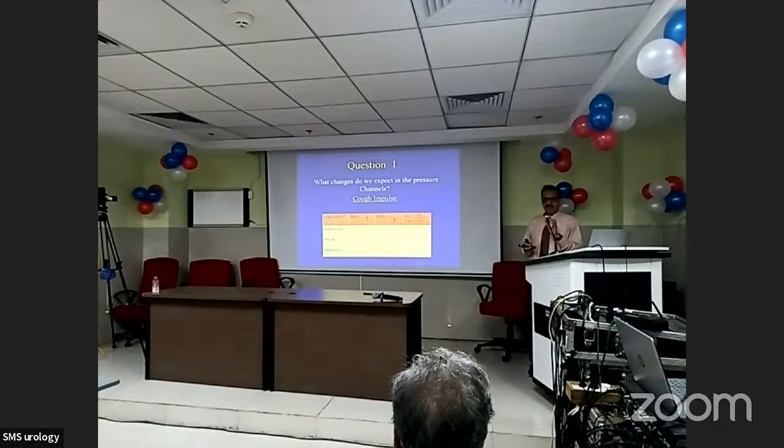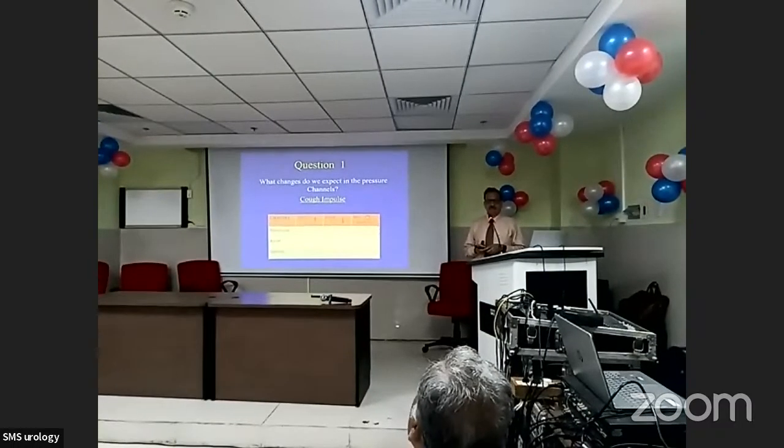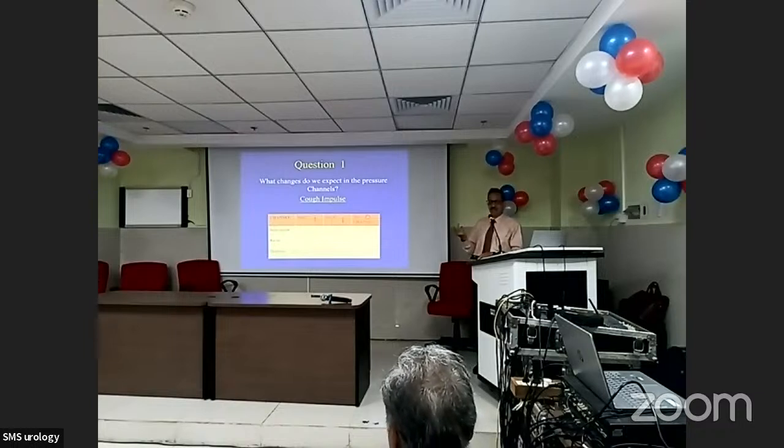But now that we are in urodynamic investigation, I would like to put some questions to the audience. You're all aware, from previous speakers, about measurement of pressures. We measure intravesical pressure by putting a catheter in the bladder, and abdominal pressure by putting a catheter in the rectum. And why do we measure two pressures?